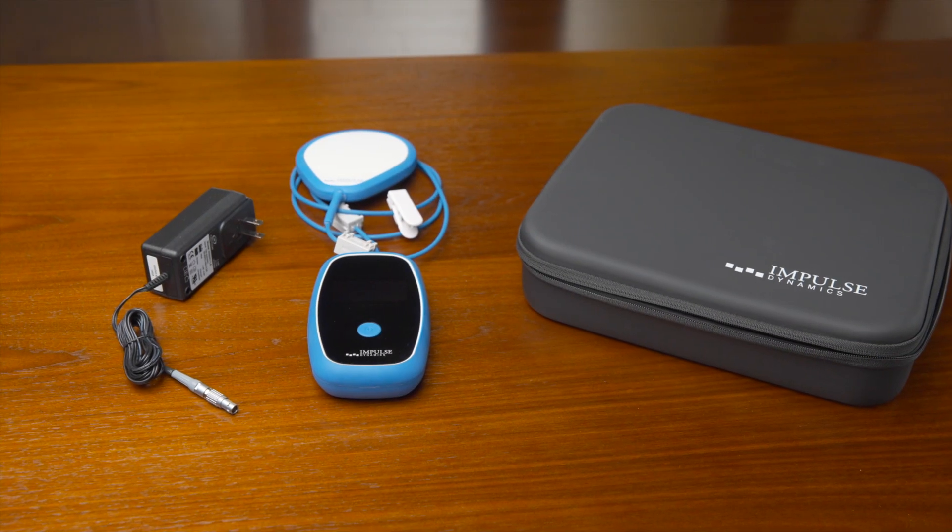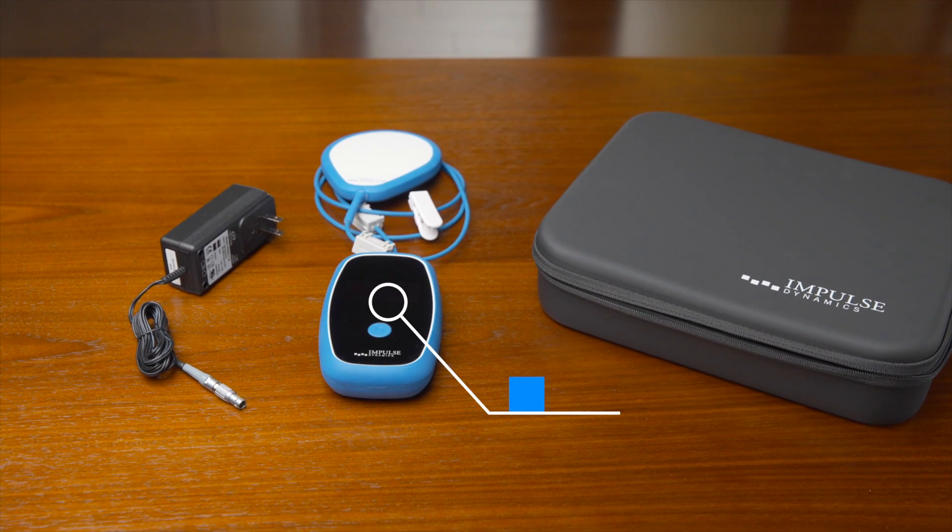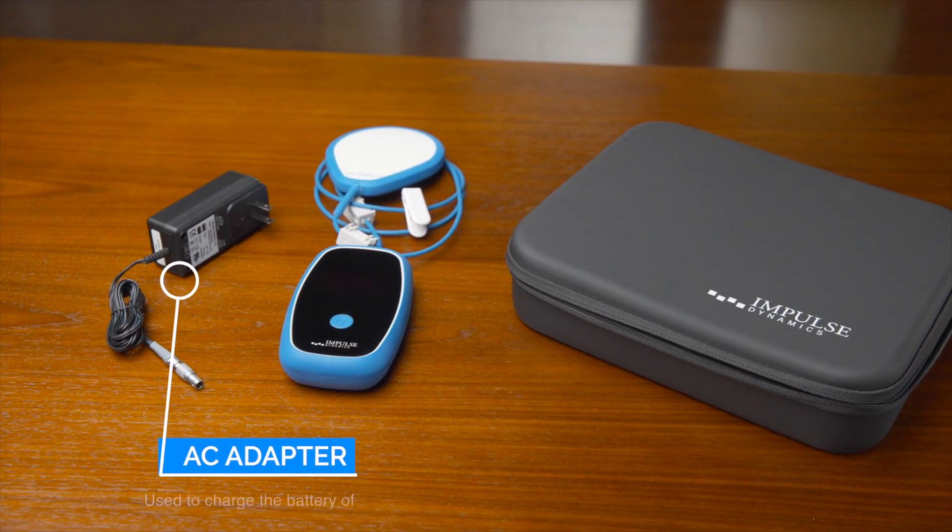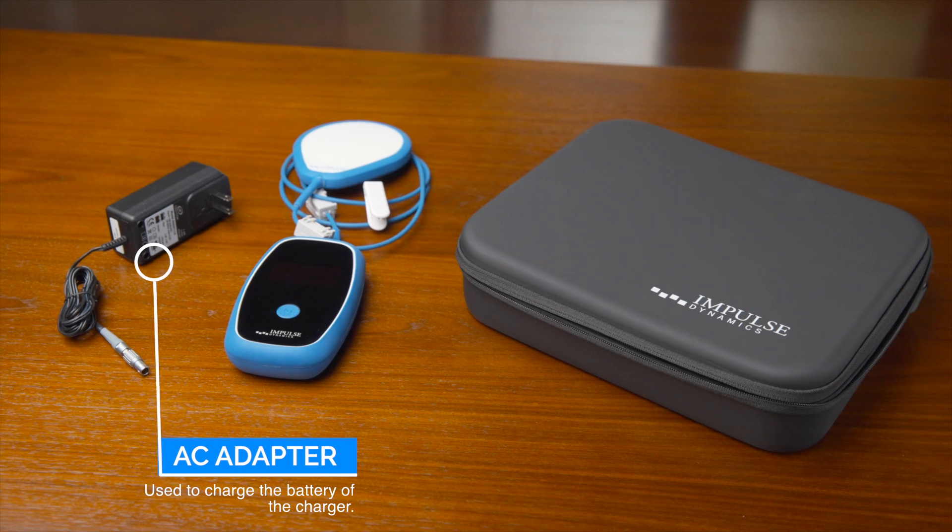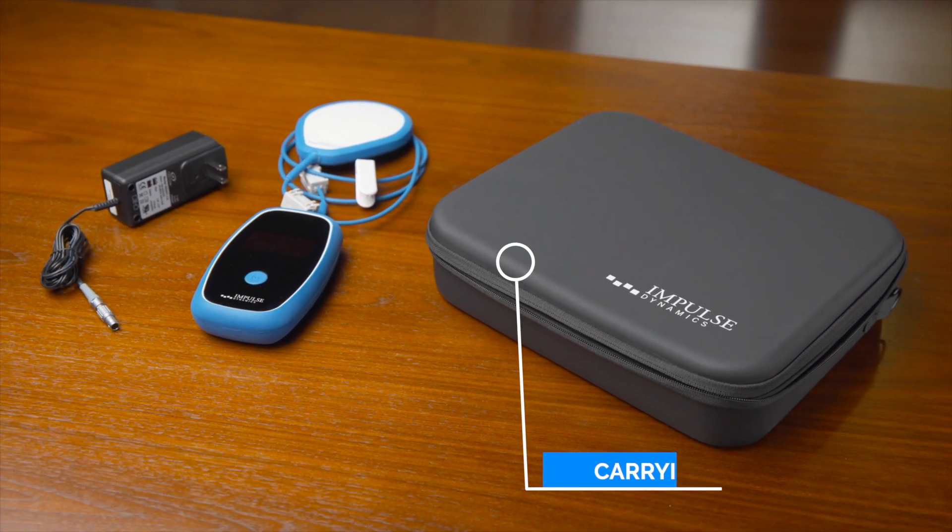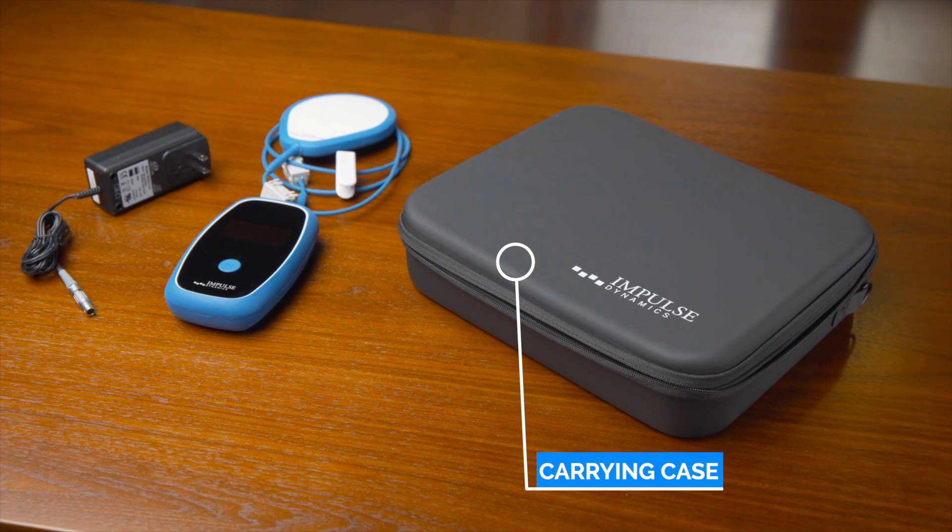The charging system includes the following: charger with attached charging wand, AC adapter (the external power supply is used to charge the internal battery of the charger), and carrying case for the charger and AC adapter.